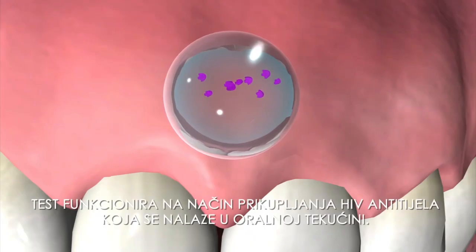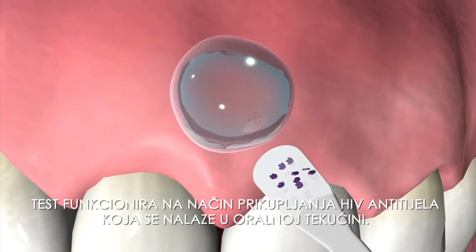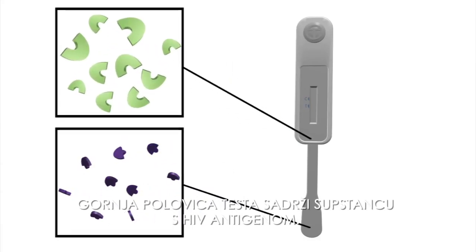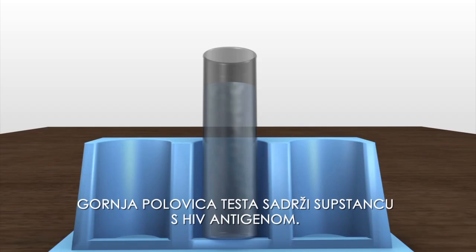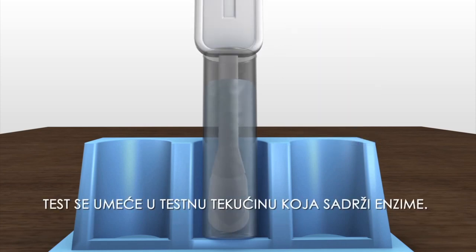The test works because an HIV carrier would have HIV antibodies in their oral fluid. The upper half of the test paper contains a substance with the makeup of HIV antigens. The test kit is inserted into an enzyme containing test fluid.